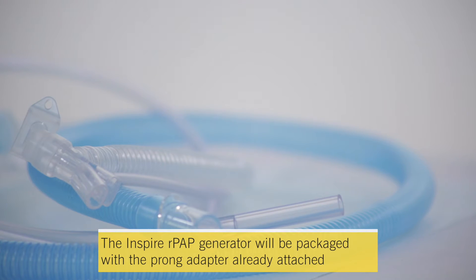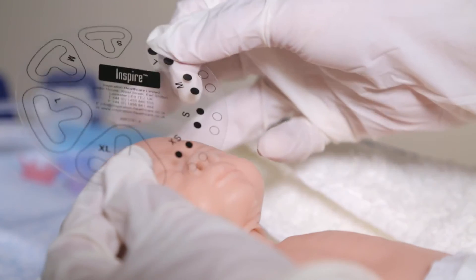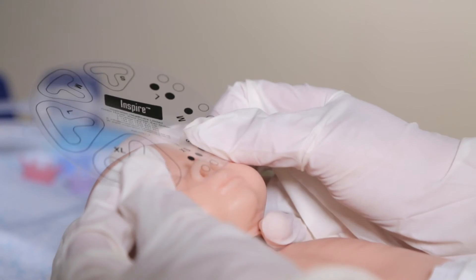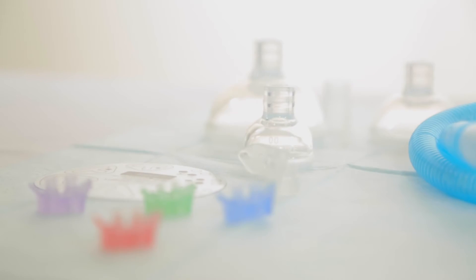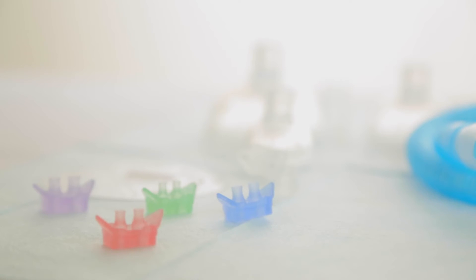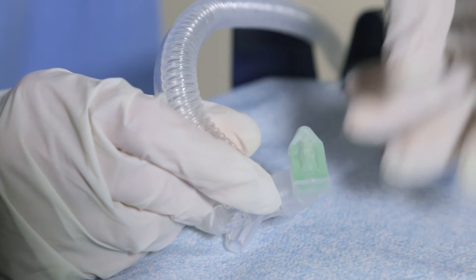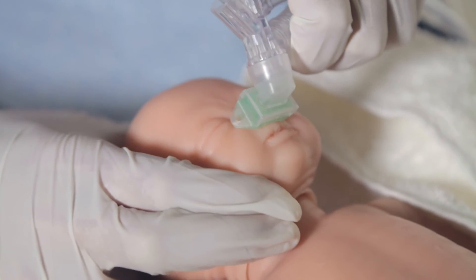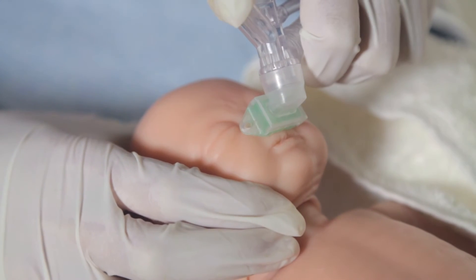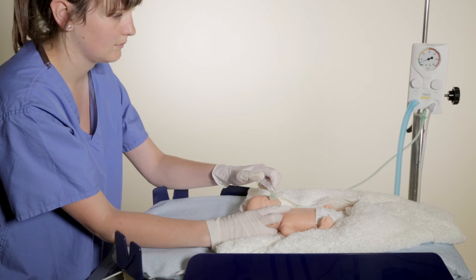The Inspire RPAP generator will be packaged with the prong adapter already attached. To perform resuscitation nasally, select the appropriate size nasal prong for the infant using the nasal size guide. It is recommended that the largest size prong appropriate for the infant is used. Next, fit the nasal prong to the nasal prong adapter on the Inspire RPAP generator. When ready to begin resuscitation, align the RPAP generator and nasal prongs to the nose. Using a gentle motion, insert the nasal prongs into the infant's nares.